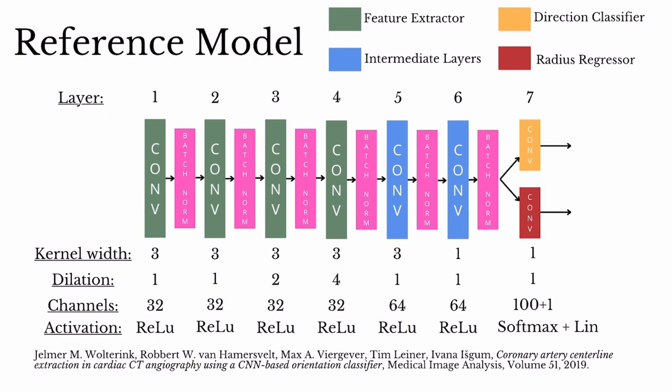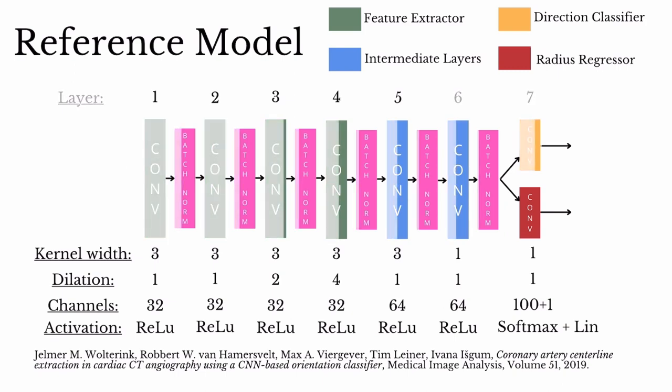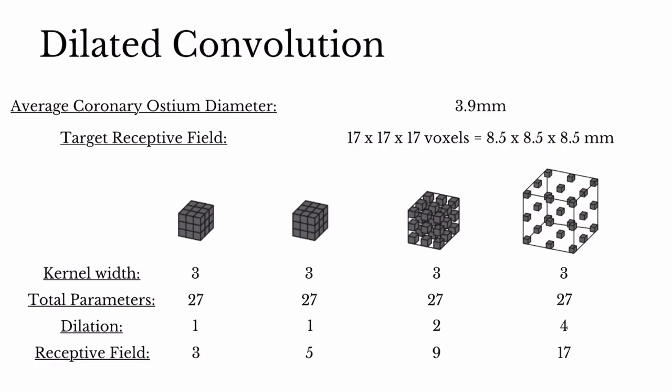The subsequent step was to design the convolutional neural network. The reference architecture was taken from the literature, and it consists of a fully convolutional neural network divided into a feature extraction network, composed of a stack of 4 dilated convolutions, and a feature classification and regressor network, composed of convolutions of stride 1. Our models had the goal to minimize inference time while retaining a high performance.